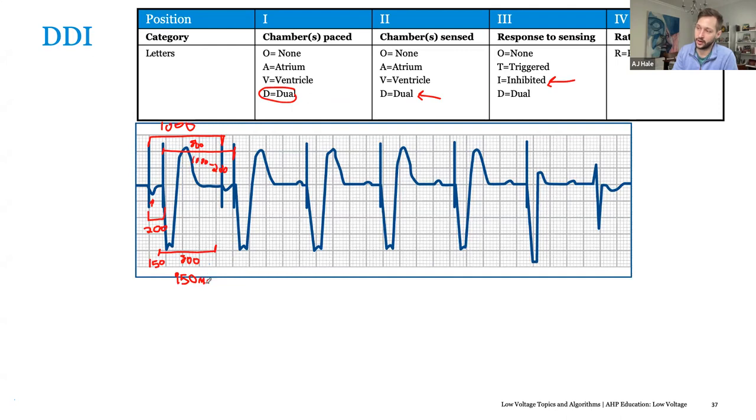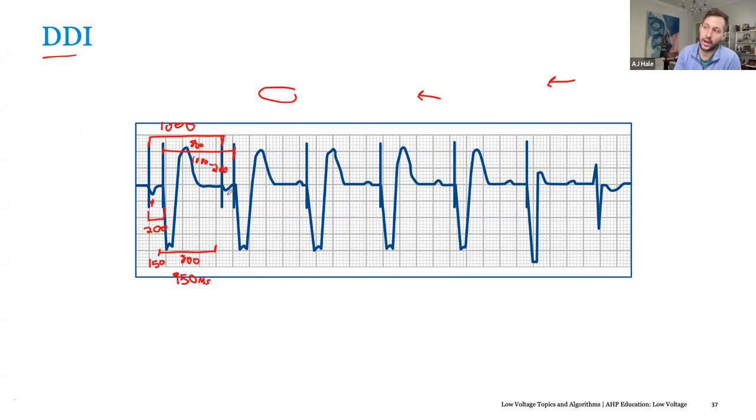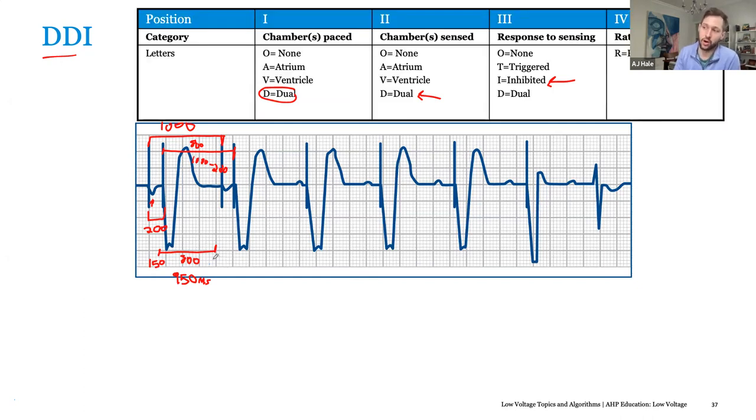And everyone's like, why does this matter? Because you'll see weird things, and it won't make as much sense if you don't know what's occurring. So just remember that DDI is a modified ventricular based timing. It's basically VVI adding atrial activity as well. Elvis, this is going to matter to you when you take the test, because they're going to ask you, why did this atrial pace occur earlier than 1000 milliseconds? Why did it occur at 950? When you take the IBHRE, that's why, because it's ventricular based timing. I know that is kind of weird and complicated. So if anyone has any questions, let me know.